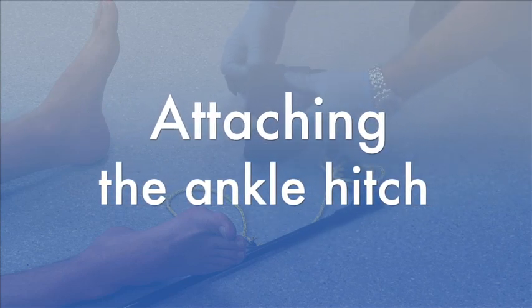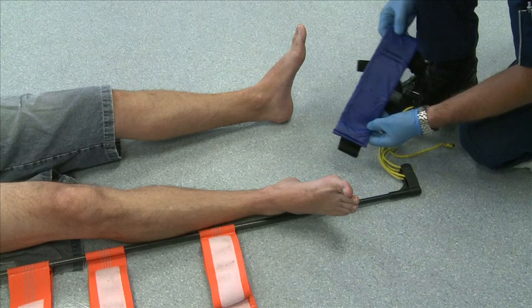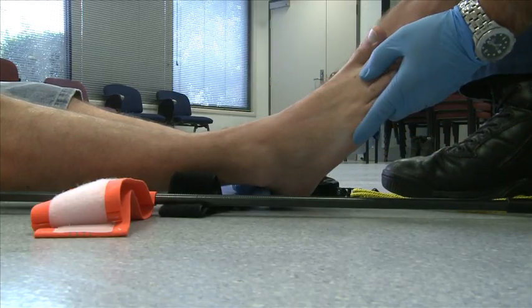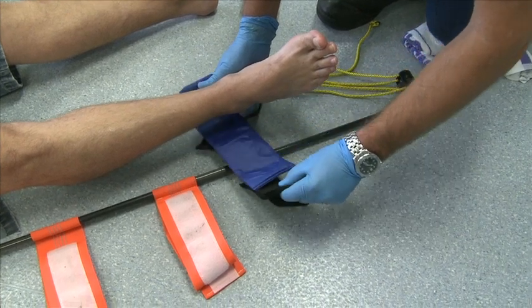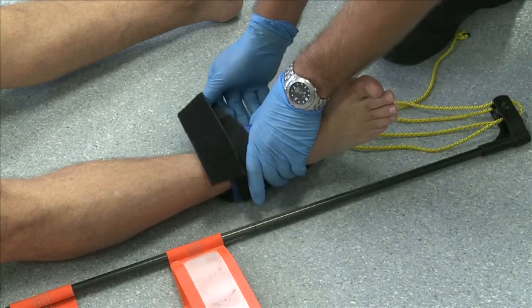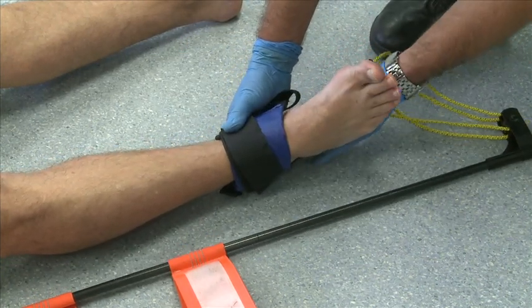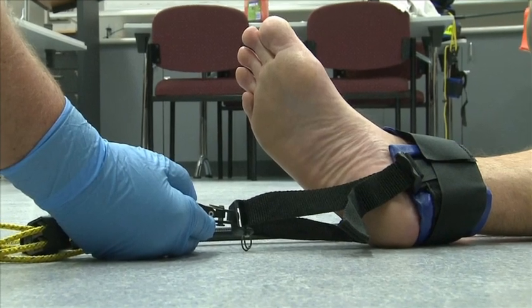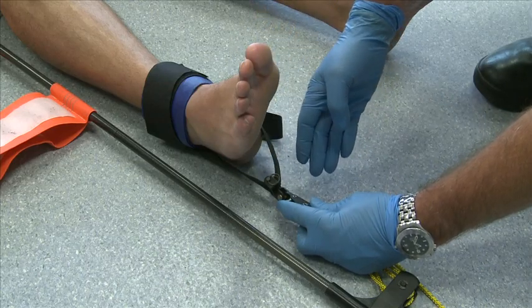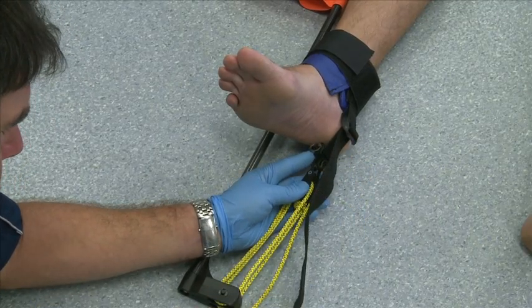Step 7 — Attach ankle hitch: unwrap the velcro strap and align the hitch with the patient's leg. Gently lift the patient's foot enough to slide the hitch under the ankle. The thicker strap should be positioned wrapped around the patient's ankle directly above the foot. The second strap should run beneath the patient's foot and align equally on opposite sides of the ankle. Tighten the strap to minimise the distance between itself and the bottom of the patient's foot.